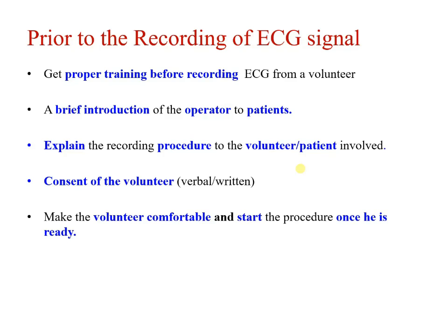For that, there are certain rules, or key points, that you need to remember and always keep in mind while doing your recording. The first and most important point is getting the proper training before recording. There are many important things involved that may lead to a noisy or bad quality ECG signal.